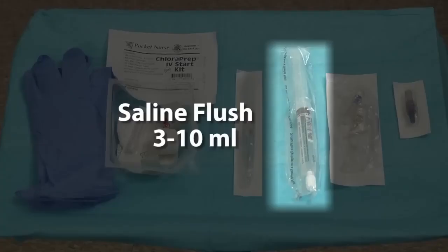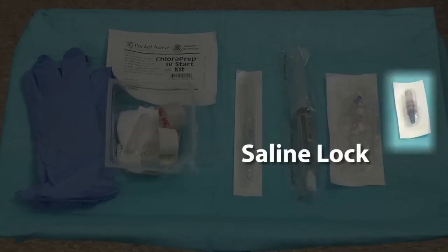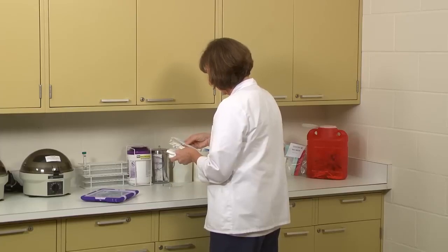Saline flush 3 to 10 milliliters, extension tubing, and saline lock. Supplies may vary slightly at your agency. Remember to check all expiration dates. All right, Mrs. Patient, here I come.